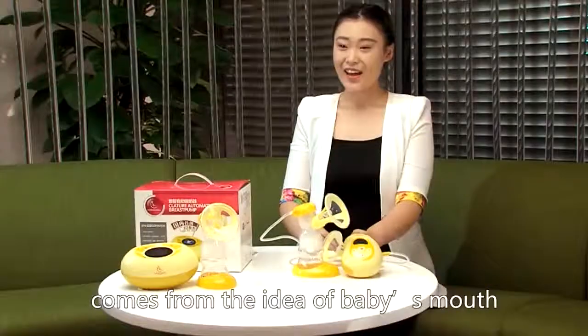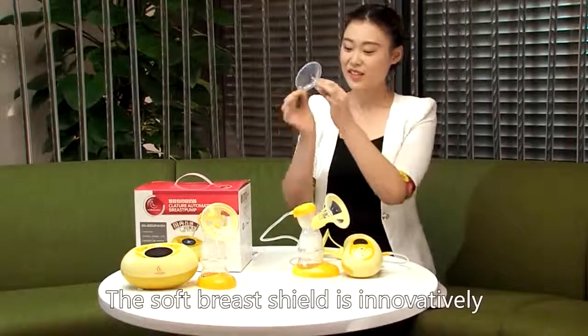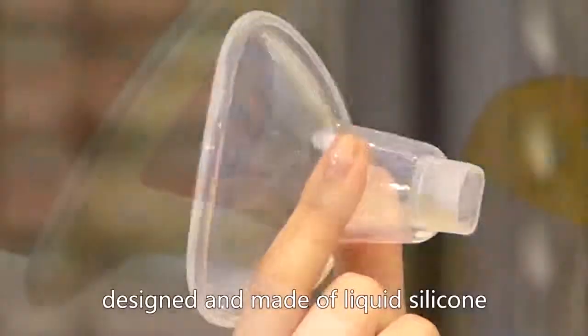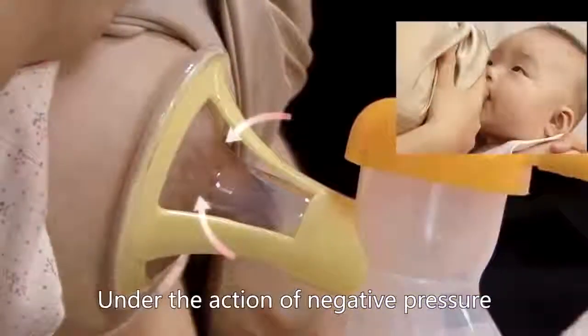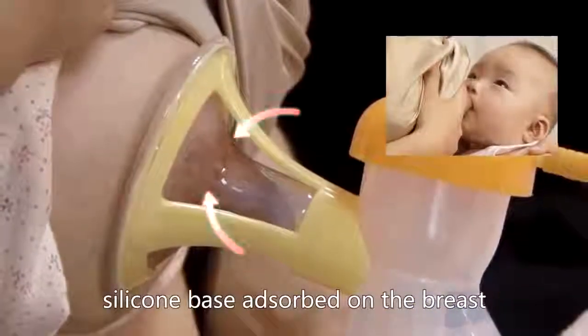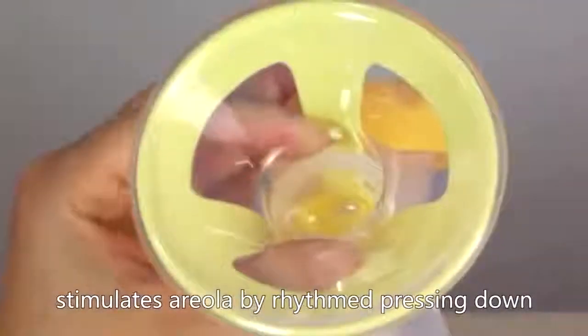Horigin's 3D Breast Pump comes from the idea of a baby's mouth. The soft breast shield is innovatively designed and made of liquid silicone. Under the action of negative pressure, the silicone base is absorbed on the breast and stimulates the areola by rhythmically depressing down.